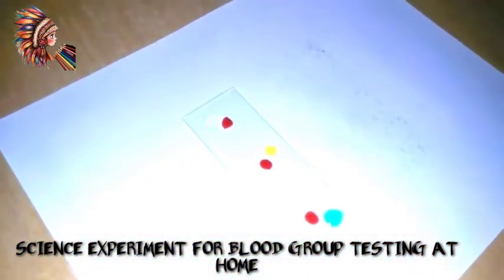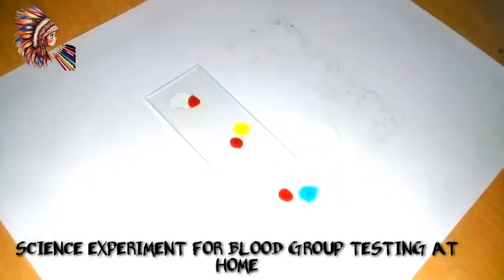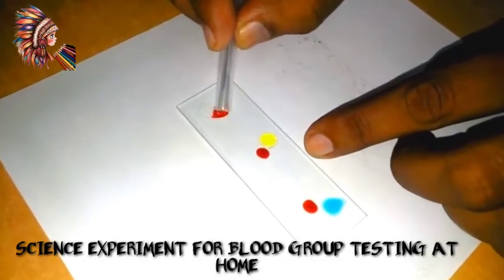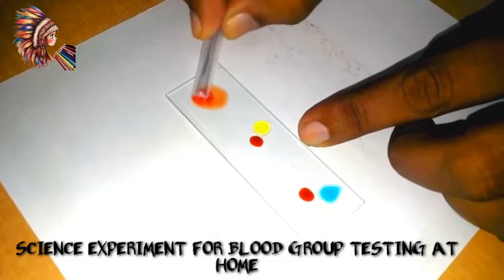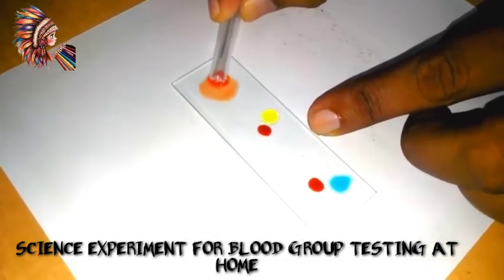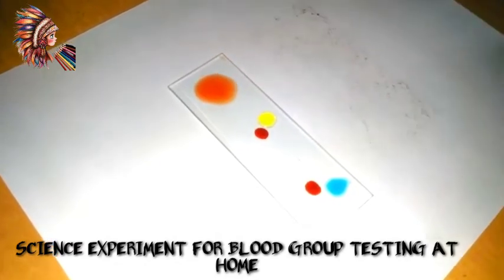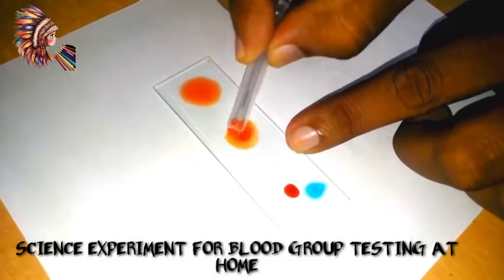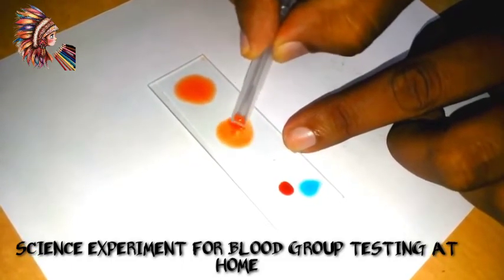Now we will take the slide and with the four corners of the slide we will mix the blood and the solution. We will wait for about two minutes — an antigen-antibody reaction will happen and you will see it in the form of agglutination, a clumping reaction.